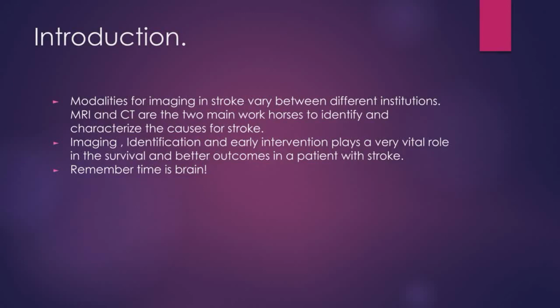MRI and CT are the two main workhorses to identify and characterize the causes for stroke. Imaging, identification and early intervention play a very vital role in the survival and better outcomes in a patient with stroke. Remember, time is brain.